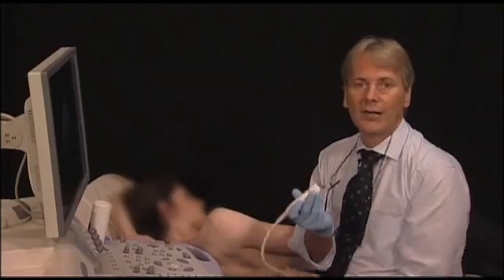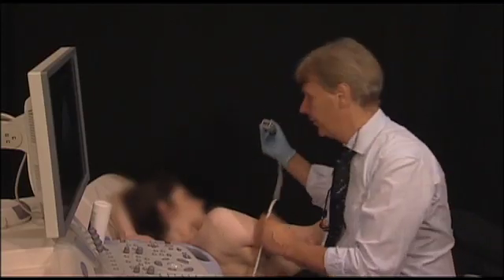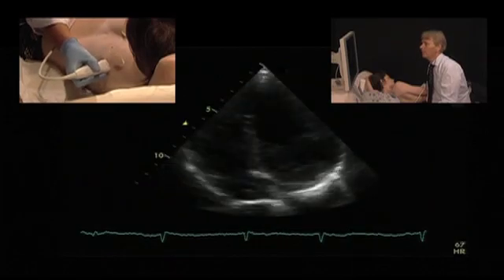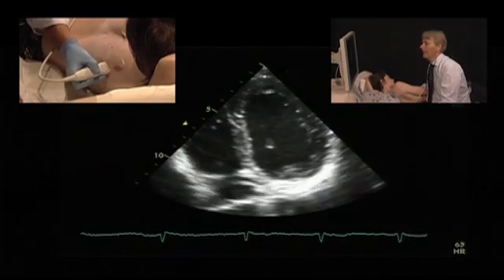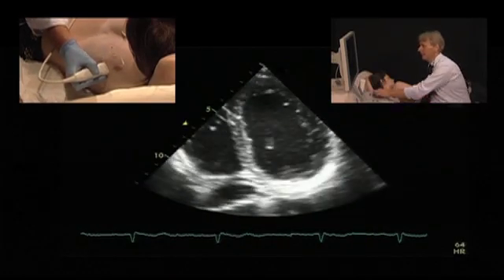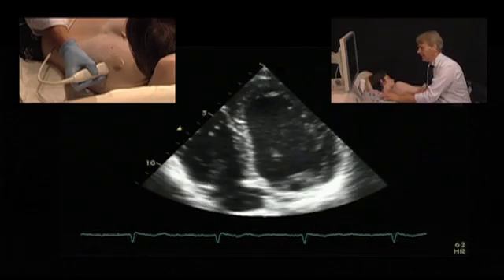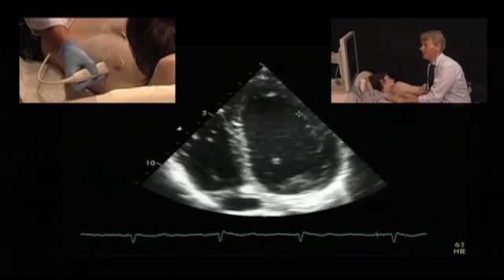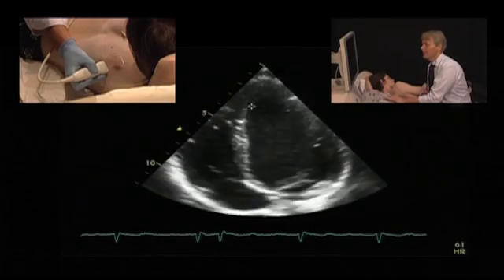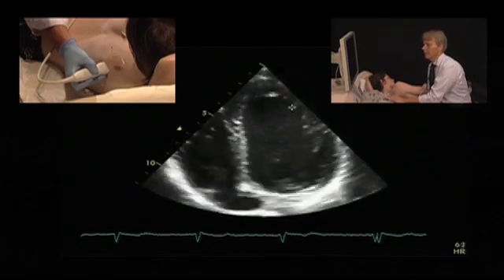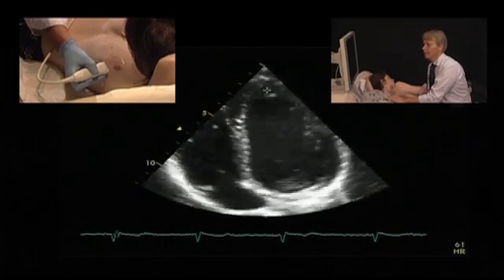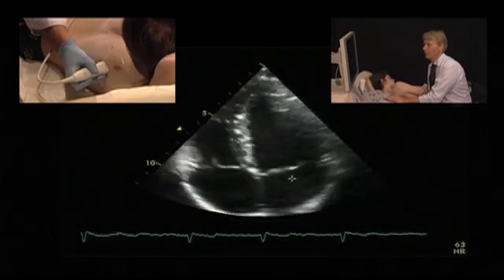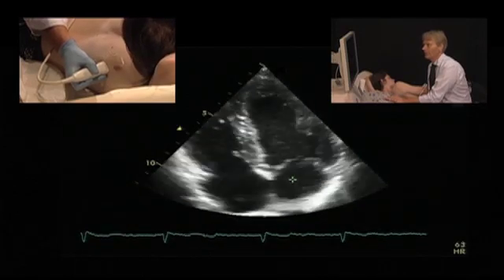So how do I recognize that there is foreshortening? The most important finding is that you have a rounded apical shape. You see, the apex is not pointed but round. The second finding is that you have a rather short left ventricle, especially when compared to the atrium.